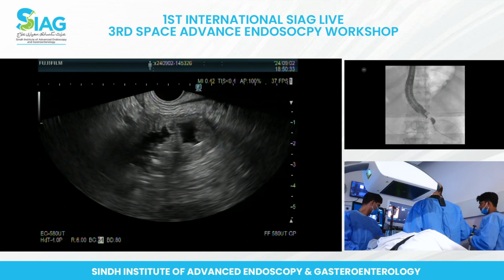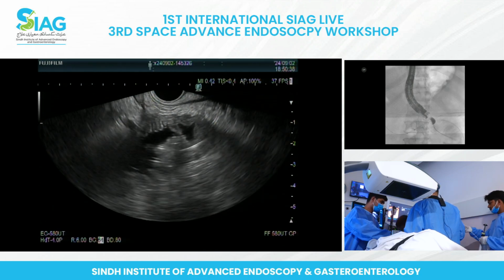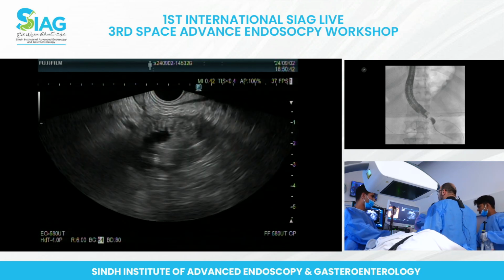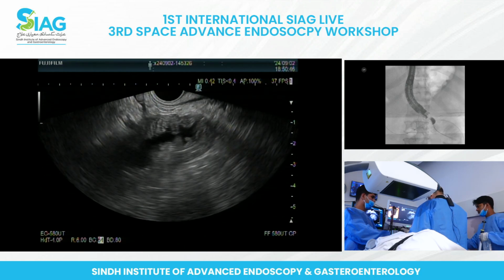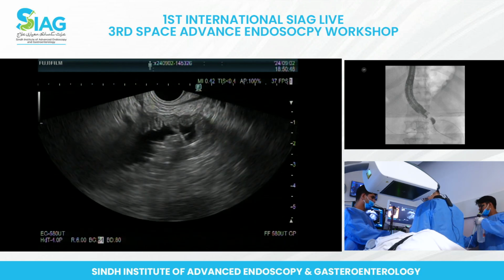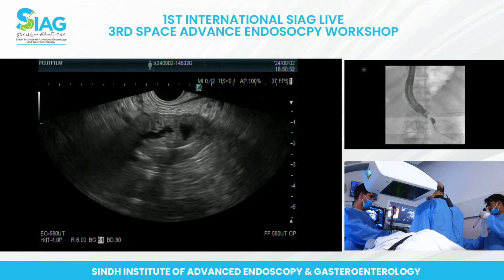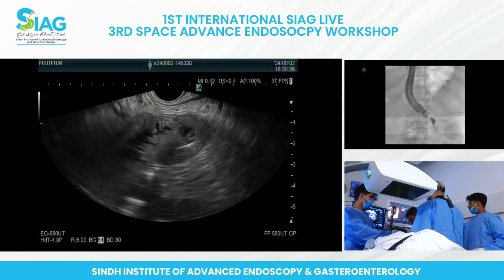So when you're selecting the stent size, the bigger is better? Not necessarily. I think bigger is certainly available. Especially early on, I would suggest going with the 15, because the 20 is a bit stiffer, and deployment can be more challenging than a 15.